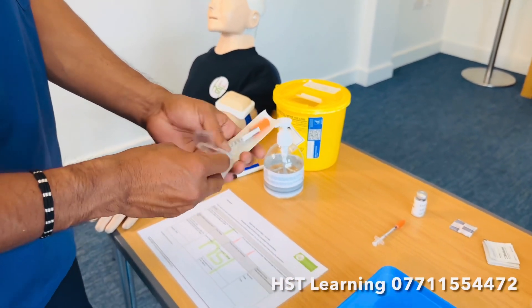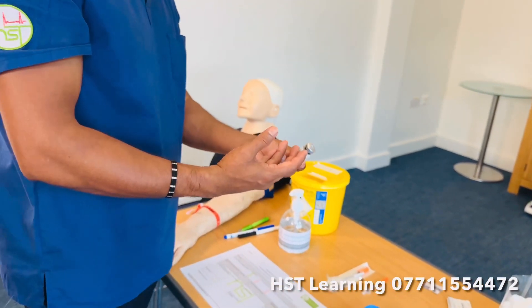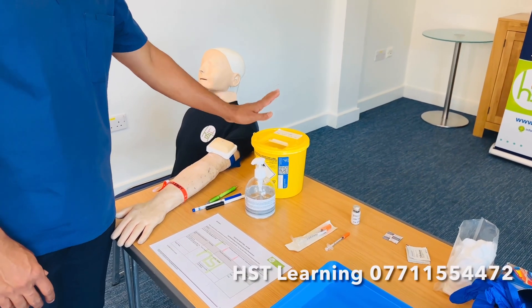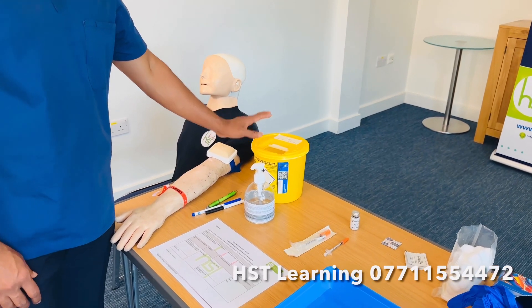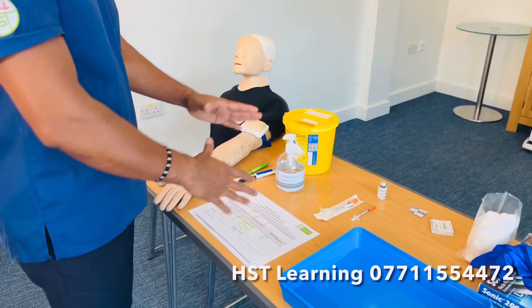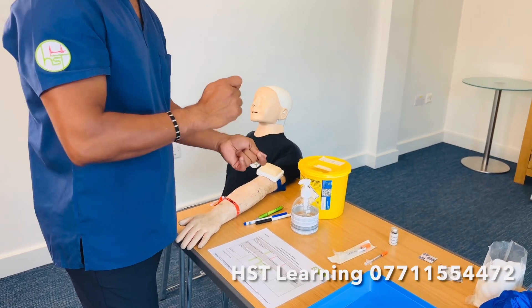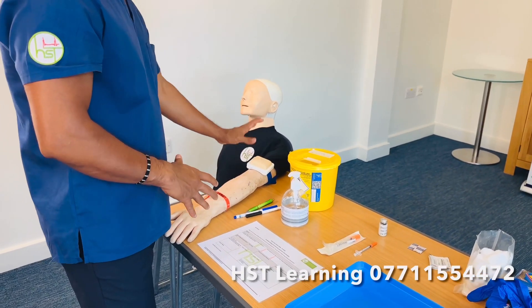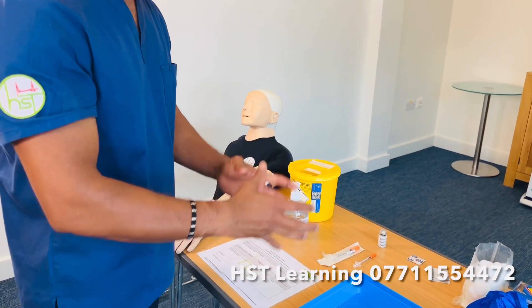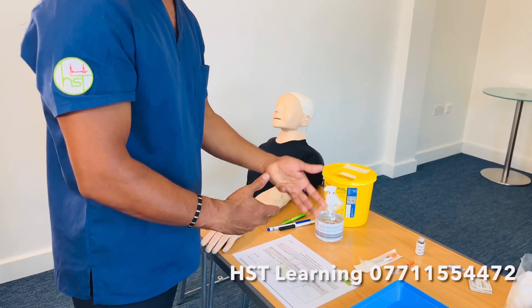For insulin medication you need to draw the medication. The sharp bin is available and you only need to use it at the end when throwing the insulin syringe. A good thing about the insulin syringe is the needle is already within it — you don't need to connect a needle, and you draw the medication with the same needle you're going to inject the patient with.